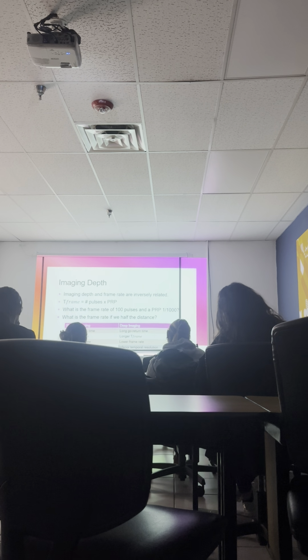Okay, so imaging depth and frame rate are inversely related, right? So the deeper the structure, the poorer the frame rate. Yes. The more shallow the structure, the better the frame rate, the improved frame rate. Okay, they're inversely related.